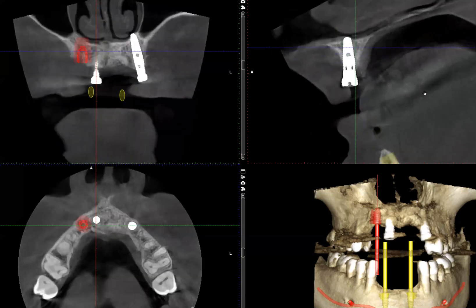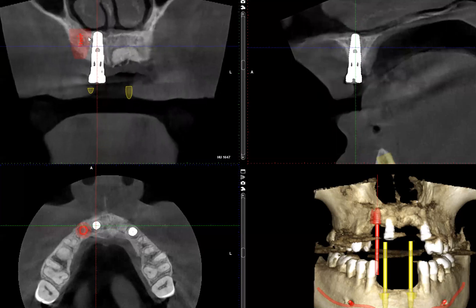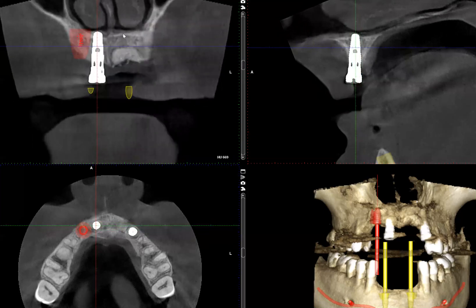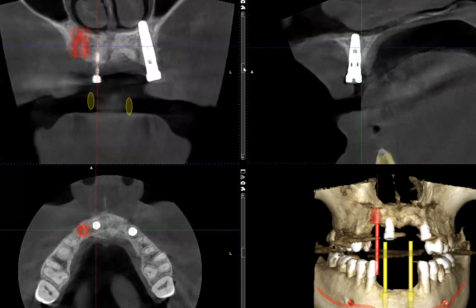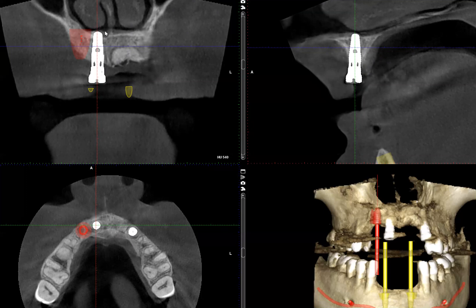If I rotate the volume so that we can see the true coronal image, once again we verify that the apical portion is located above the floor of the nasal cavity. What's also interesting is that there is some mucosal thickening, but it doesn't appear to be any more significant on this side compared to the contralateral side. So it doesn't seem to have caused any significant localized increase of inflammation at this site.